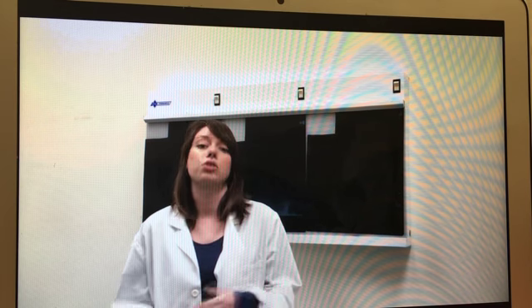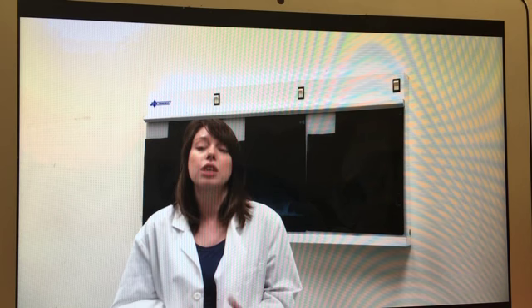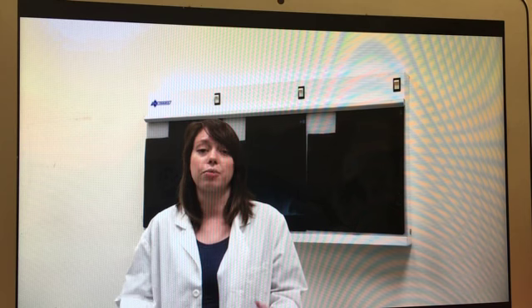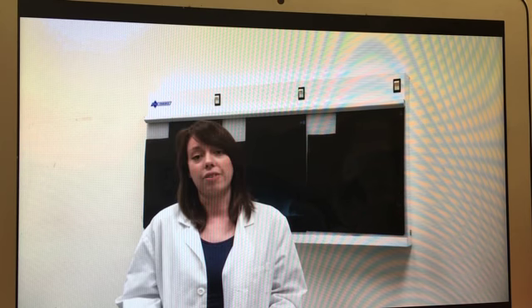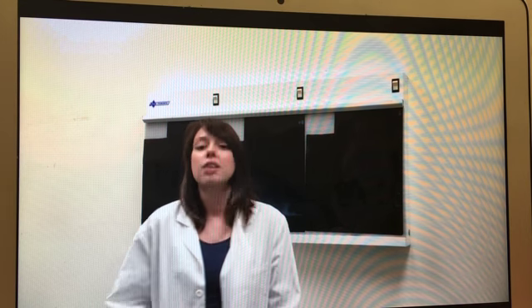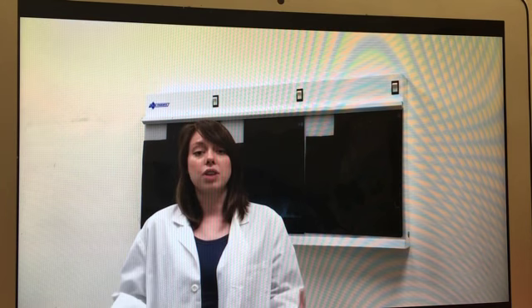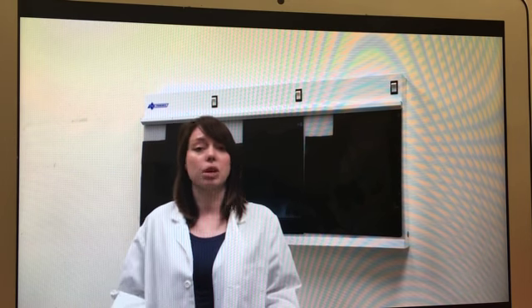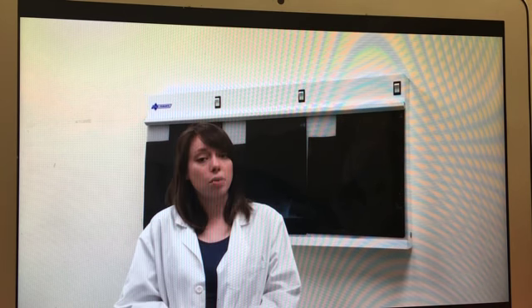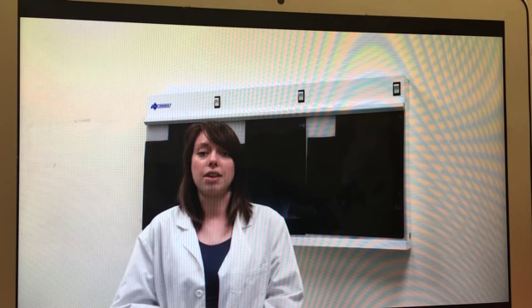Then I moved on to the sunrise, which was a little bit more difficult and painful for my patient, because in the room that I was in, it requires the patient to flex the knee more. And with that flexion, she had some pain and discomfort. So I tried to work very quickly to get her out of that position as quickly as possible. Next, we did the lateral. She was able to roll onto her side pretty well, actually, and had some pain when bending the knee, but not as much as she did with the sunrise.